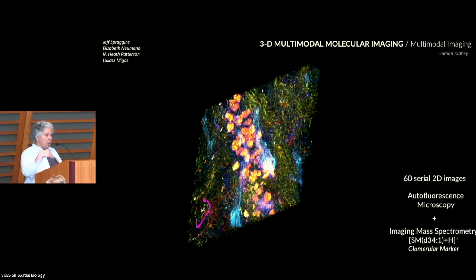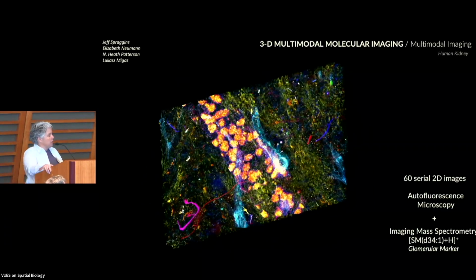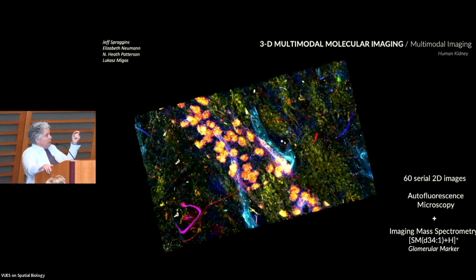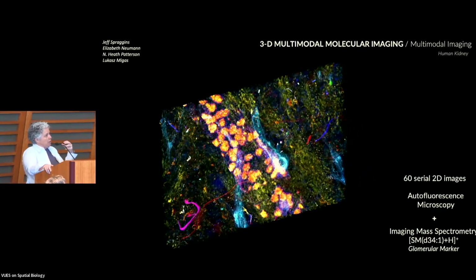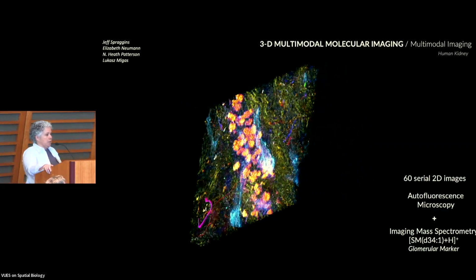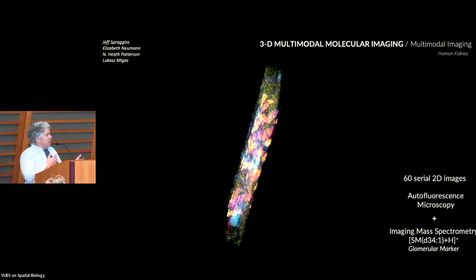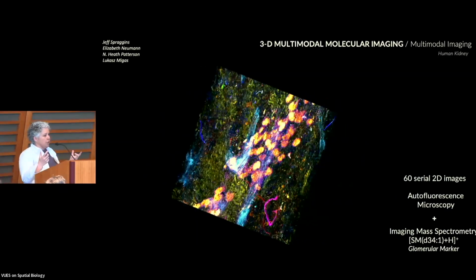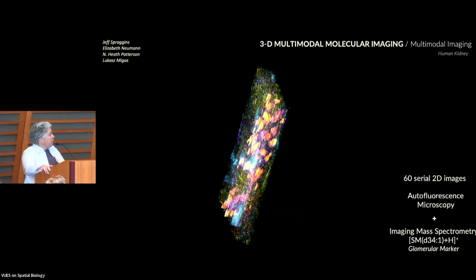And then if we can bring in our orthogonal workflows, including Xenium and CODEX, and do that cross-data mining and get some transcriptional information as well as some protein information, we could start understanding cell types, cell states, lipid distributions, and really start understanding true structure-function of a given tissue.